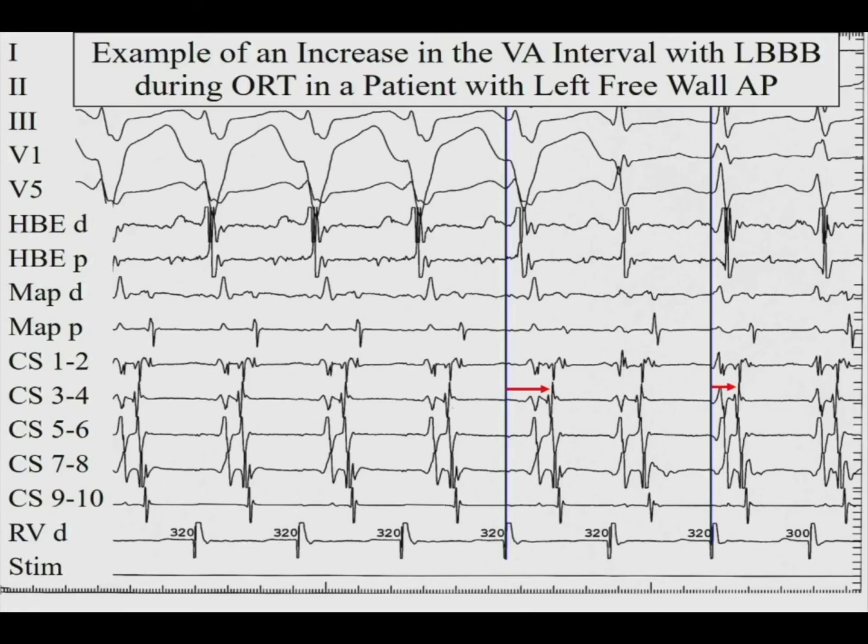So it's one of the tricks that you use when signals are not optimal. But it's key. And how do you know sometimes when you're ablating a slow pathway and you see a sharp spike at the end of the atrial electrogram, is it a His? You don't want to ablate the His. So sometimes you have to do pacing maneuvers to separate these electrograms to sort out what's A, what's His, and what's V. Just like diastolic potentials during VT, pacing will separate these.